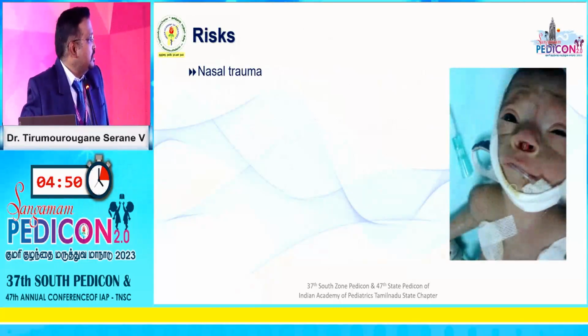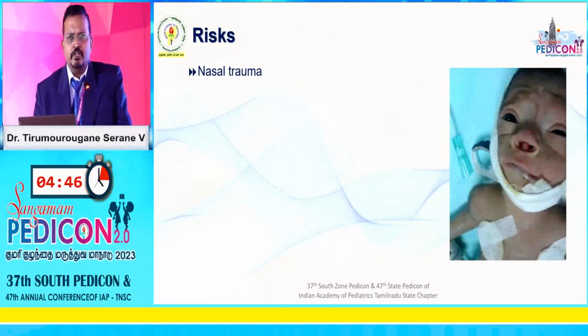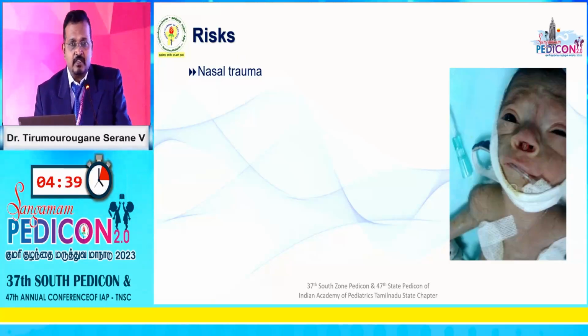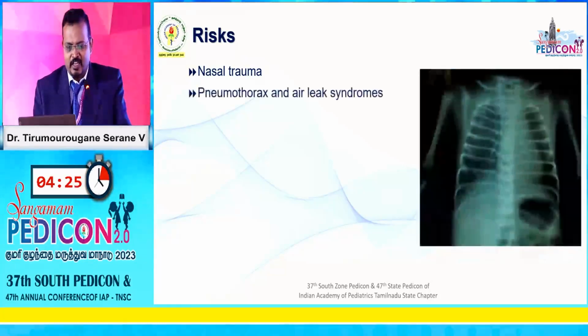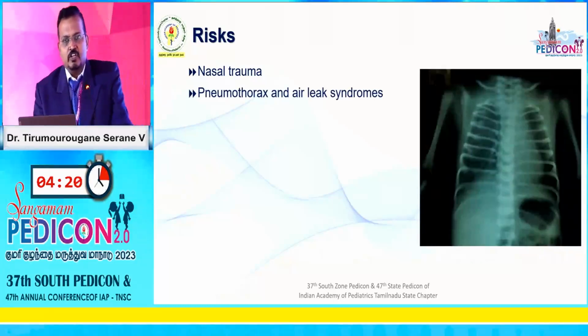Sorry. So, does it mean that it is a utopia? You got the best one to use, but please remember it's not. The incidence of nasal trauma is something which can happen, and it is really very bad. I mean, see, this baby went home alive, I think a 27-weeker went home alive. After 2 years, the parent comes and still keeps scribbling to me that the baby's nasal bone is collapsed. Okay, I cannot do a lot about it. In fact, it's 3 years. So, nasal trauma is a major problem.